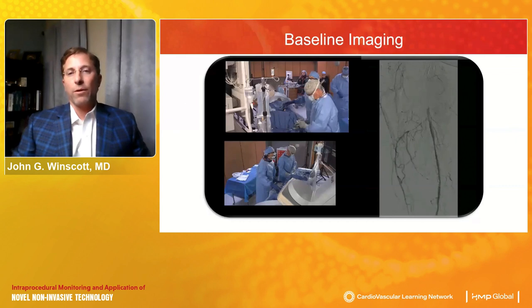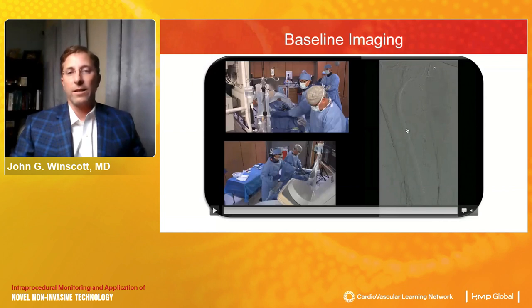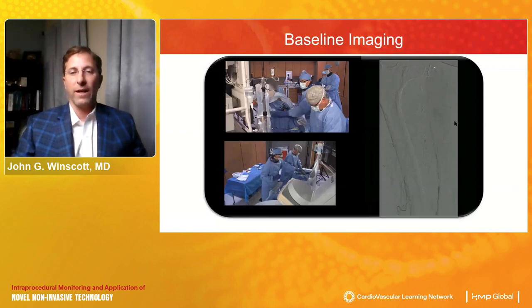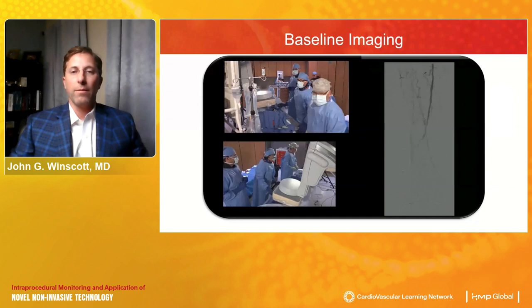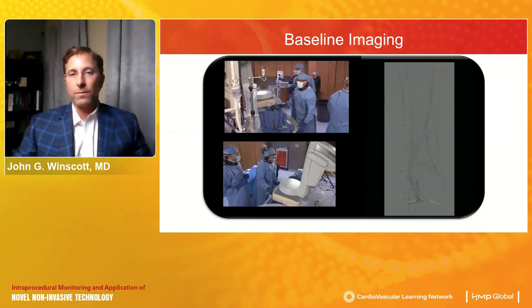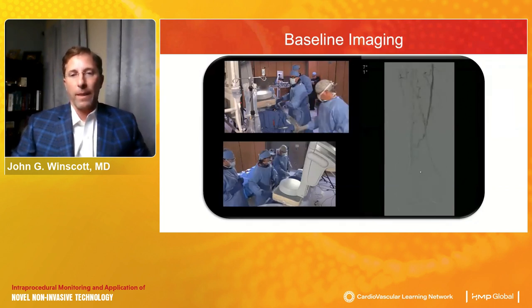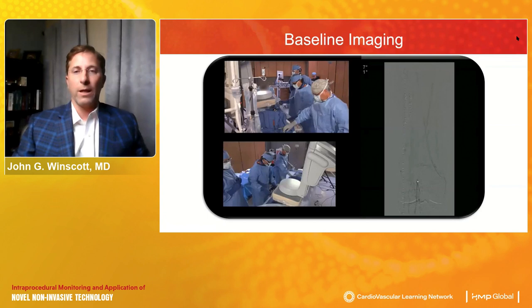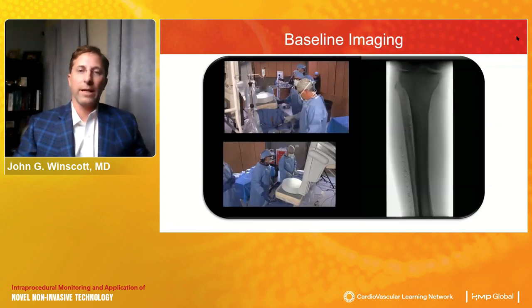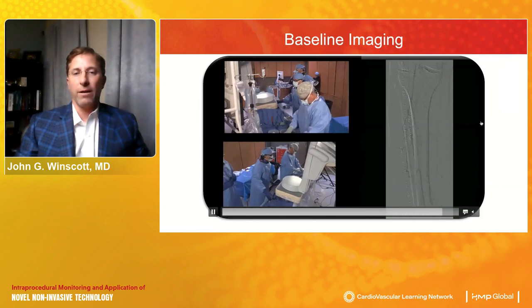So baseline imaging of the left lower extremity, you can see the common femoral artery is patent. The profundofemoral artery has its main branch occluded and there's high-grade disease in the SFA, but it is patent. But when we get to the popliteal, you can see that the popliteal occludes right at the P1 segment with a fairly complex proximal cap with reconstitution just above the joint line in the P2 segment and what appears to be a patent P3 segment on this initial angiography. However, when we get below the knee, you can see that there's actually complete occlusion of the distal popliteal and all three proximal tibial vessels. This is all a series of collaterals that reconstitute the peroneal in the mid calf.